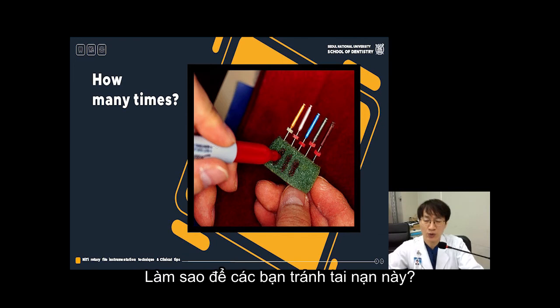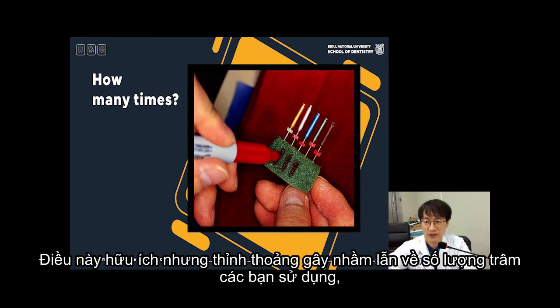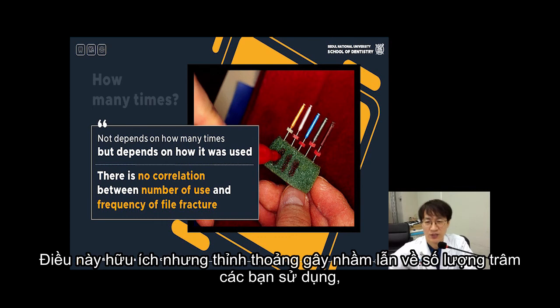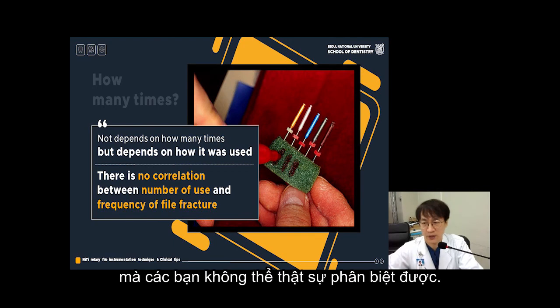So how can you prevent that kind of accident? Do you really count that file? It's helpful, but sometimes it's confusing. How many files you use, and which file do you use in severe canal, and which file you use just straight canal? That you cannot really differentiate.